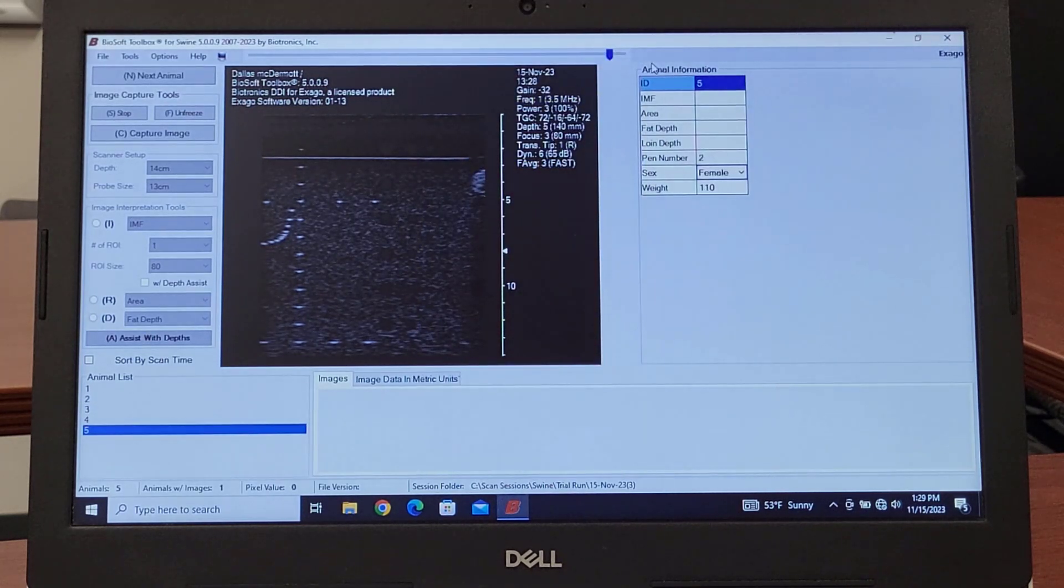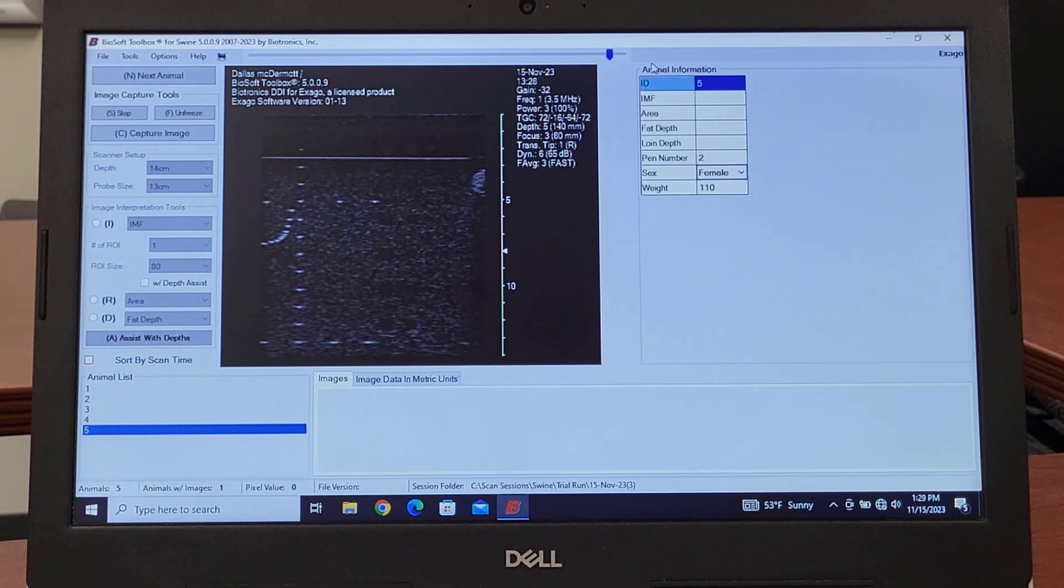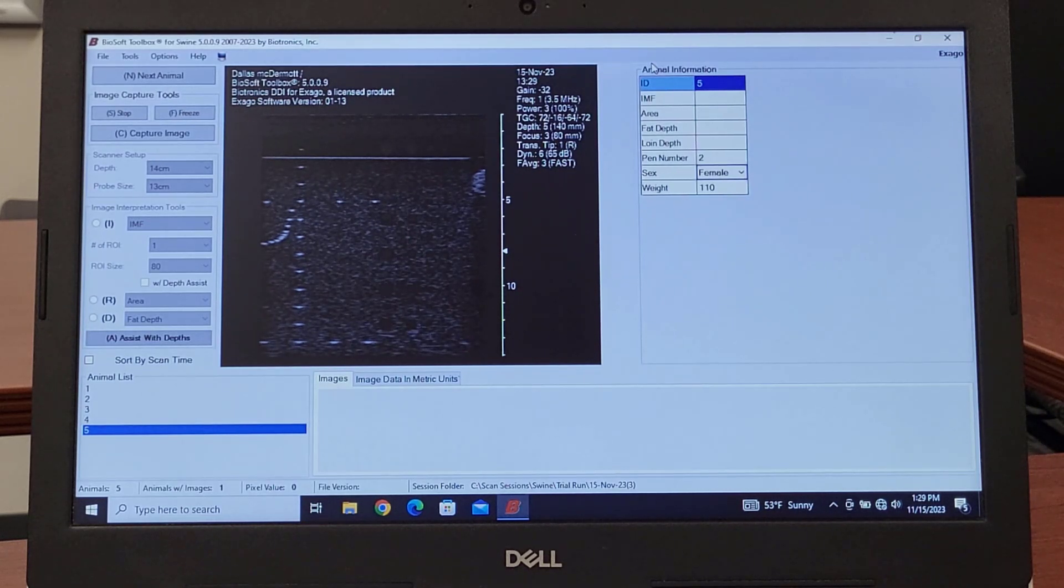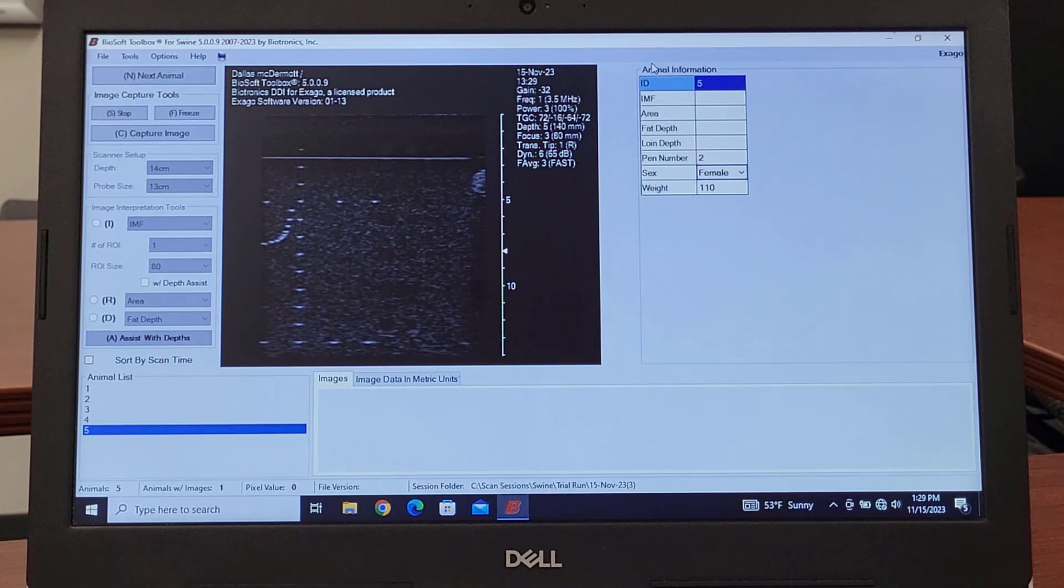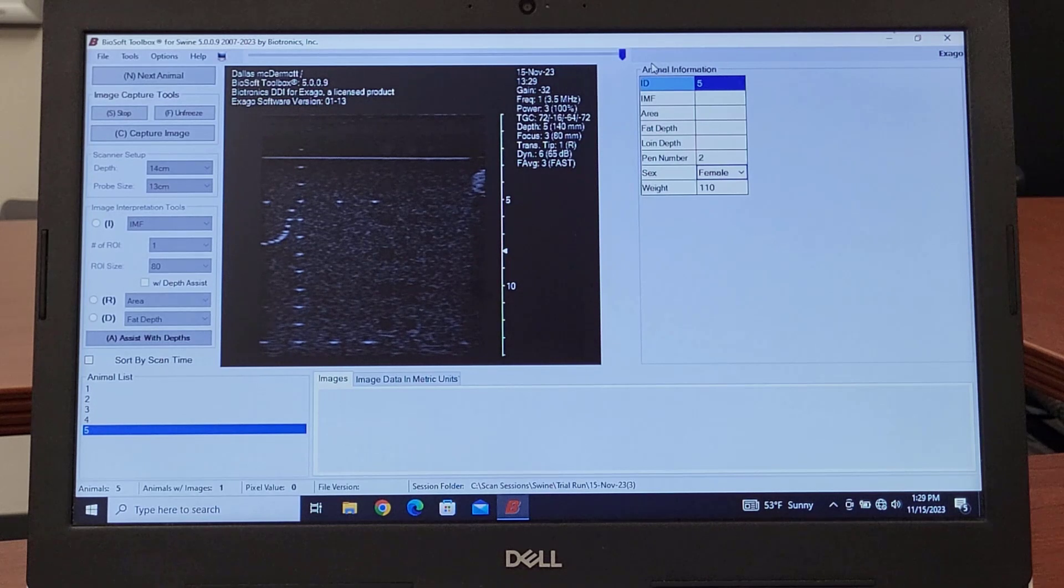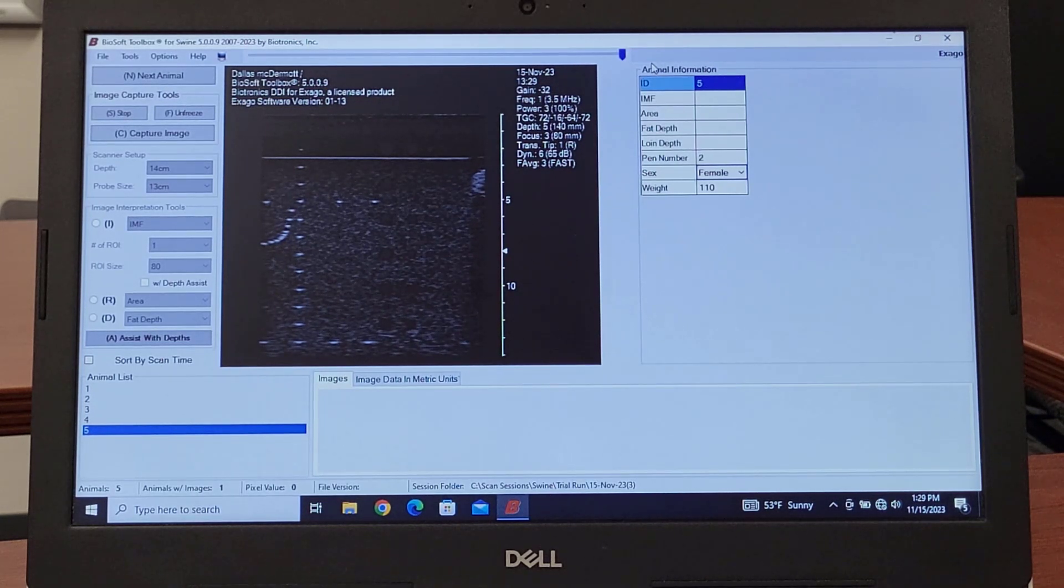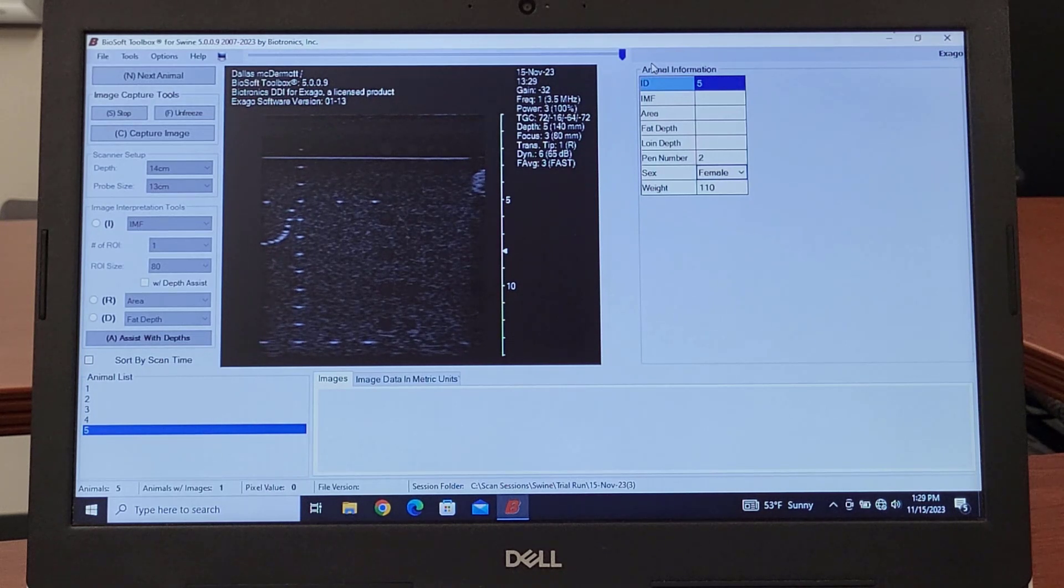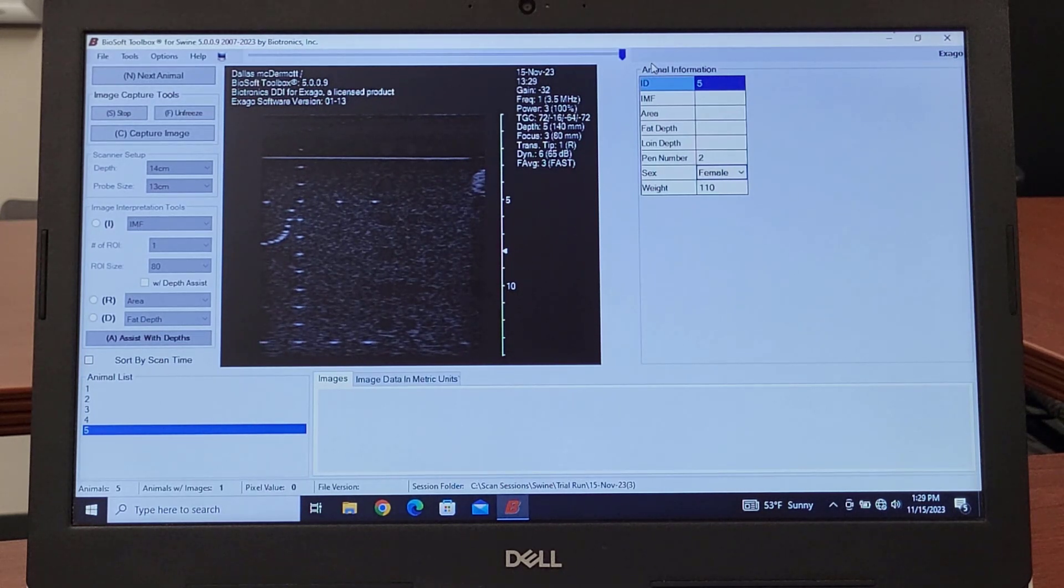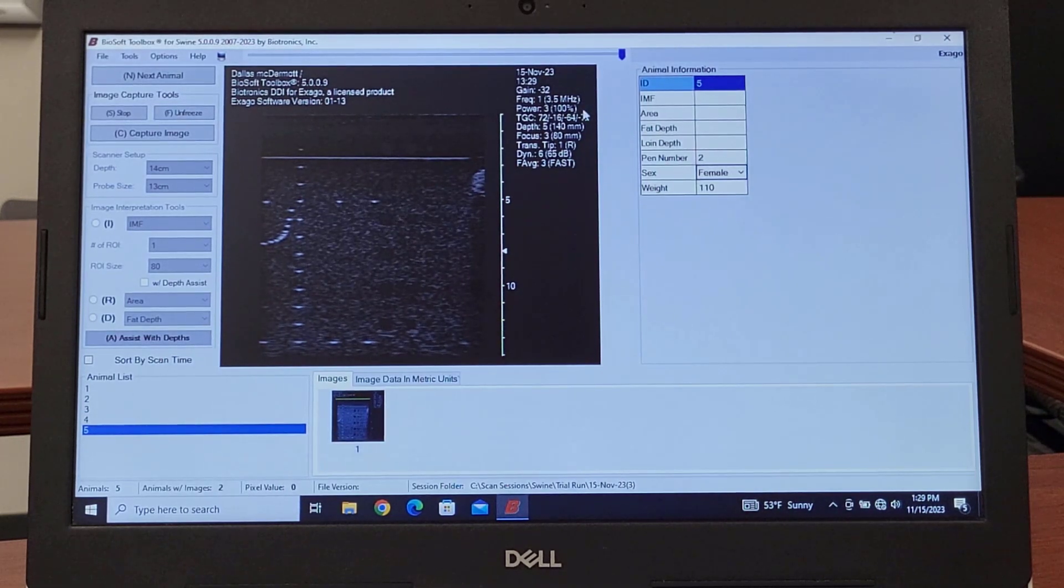We can continue to do the same thing through each one. Scan the animal, freeze the image, we unfreeze first. Buffer: that progress bar along the top indicates a buffer. It's gone. Now all of a sudden we have about eight seconds worth of scanning stored, and then we can select from that. If the last where it froze is acceptable, we can push Capture, and that's all there is to that.